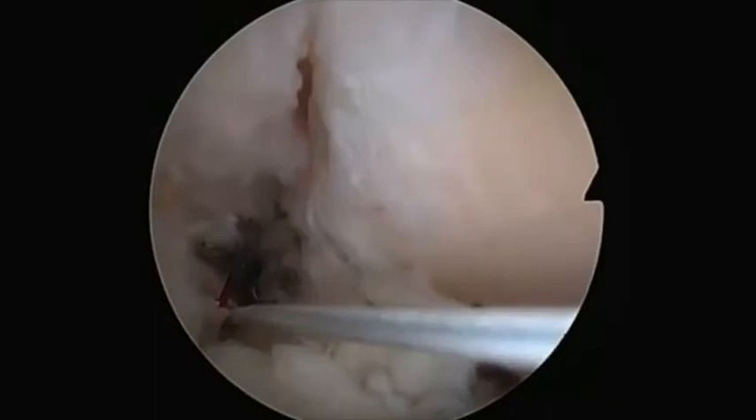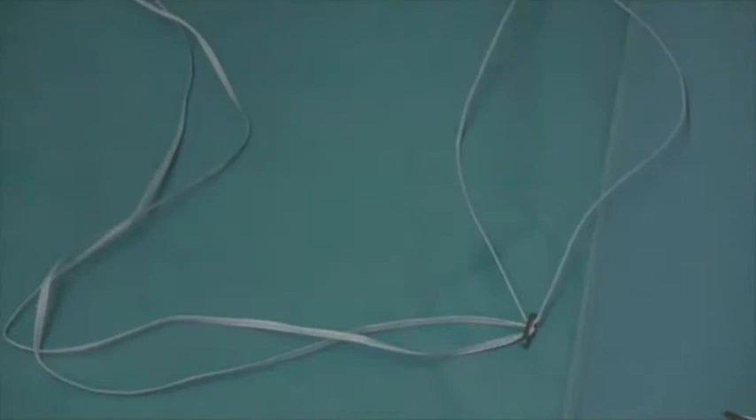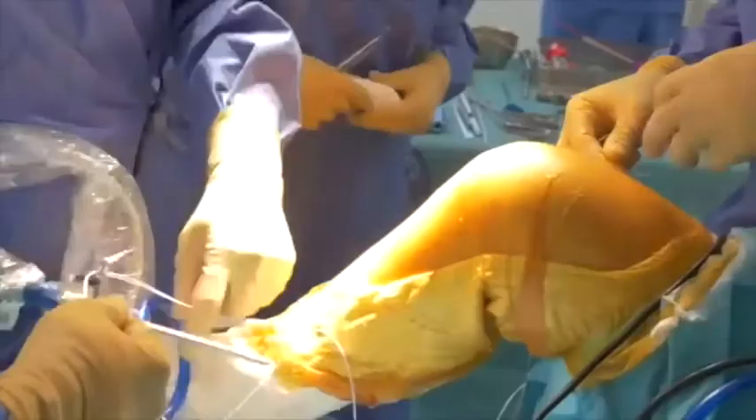The tiger wire from the ACL remnant is then combined with the tiger wire from the femur and used to shuttle the femoral tiger wire into the tibial tunnel. The tiger wire is next used to shuttle the endo button through both the tibial and femoral tunnels. This can be directly visualized using the arthroscope.